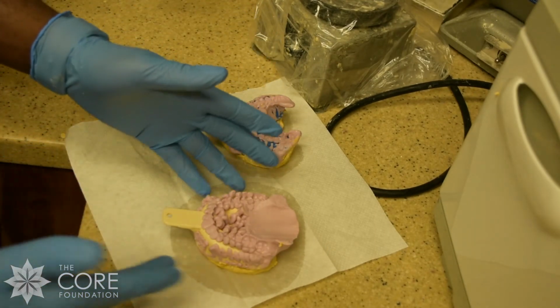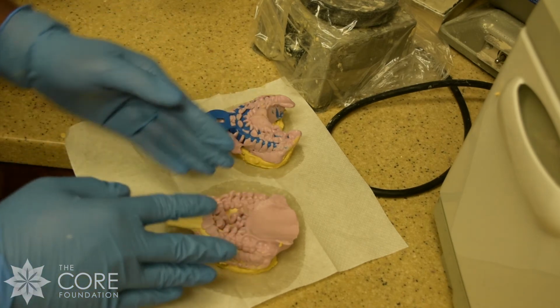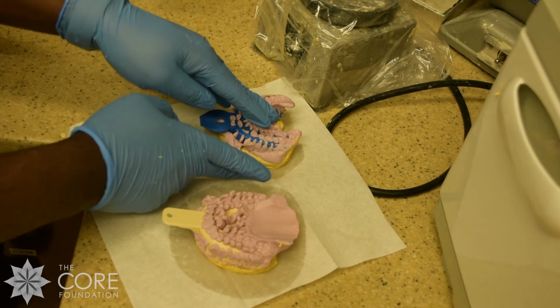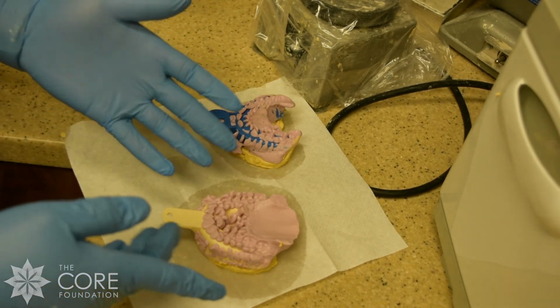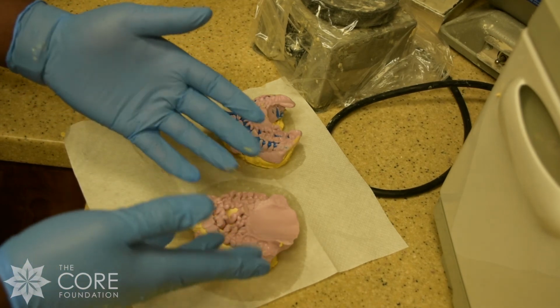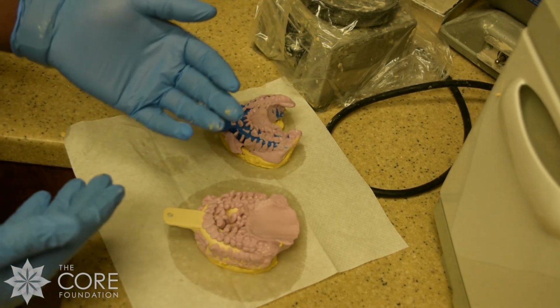So both impressions are fully poured up. We put them down, facing down on the napkin. This is to make sure we have a consistent flat surface for the base. And this is a really good impression. You can send it to a lab to make dentures. You can use it to make impression trays or bleach trays, or you can use it for making retainers, just whatever is required of that patient.